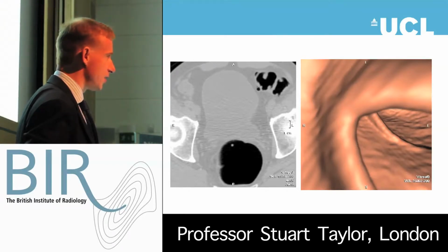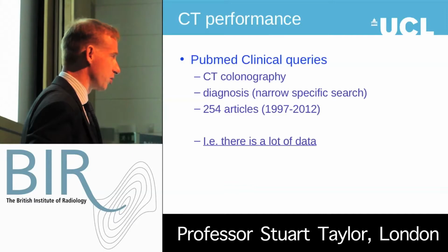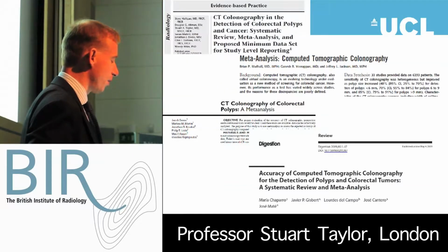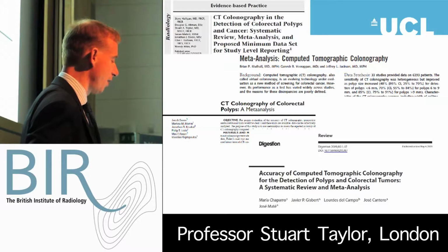So how good is CT? So I'm going to start at the end and sort of work backwards. So I'm starting with the headline figures for the diagnostic performance of CT. If you do want to look at that for yourself and you go to PubMed and do some clinical query, it's going to take you a long time because there's a lot of articles on CT colonography. It's been a very popular subject in the literature. But fortunately for us, the best way of combining those data is to do a meta-analysis, and quite a few authors have done that over the years, which basically combines the data and gives you an overall headline figure. And if we do that, this is the sort of data we get.